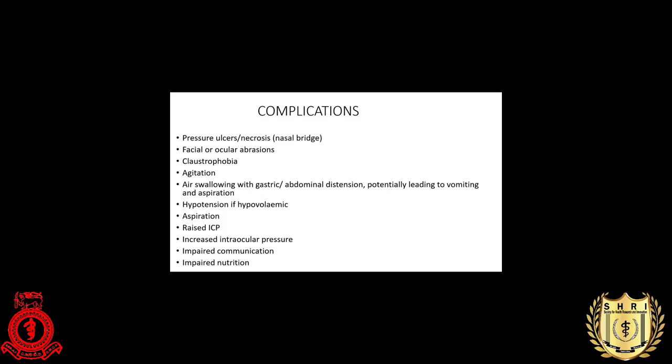What are the complications? In general, when we're using this tight-fitting mask, it can cause pressure ulcer or necrosis, especially around the nasal bridge in elderly people. It can also cause facial and ocular abrasion, and eye irritation with a loose-fitting mask, because there's air leakage from the mask going into the eye.